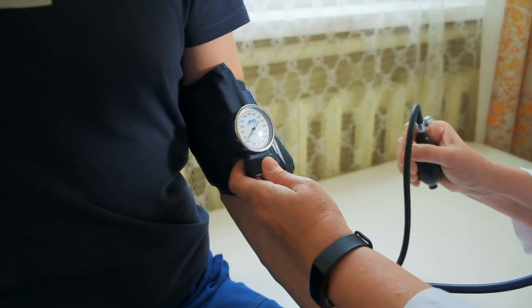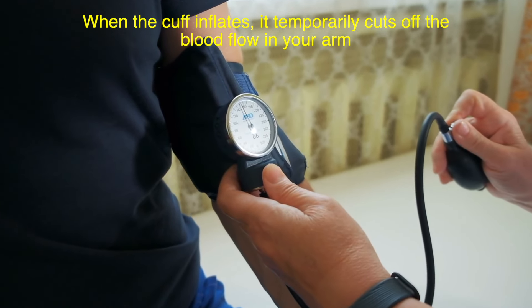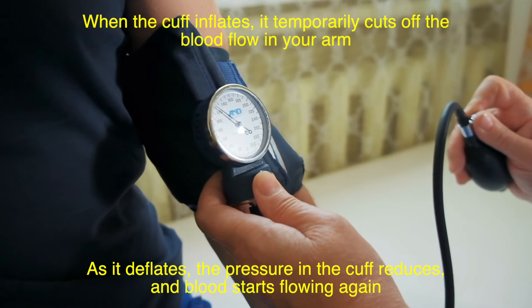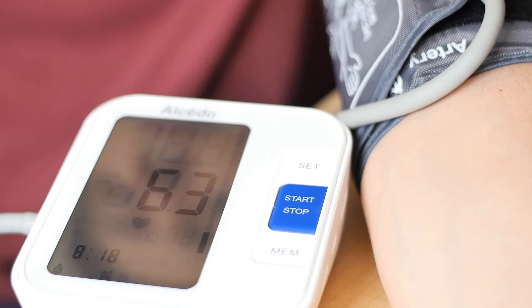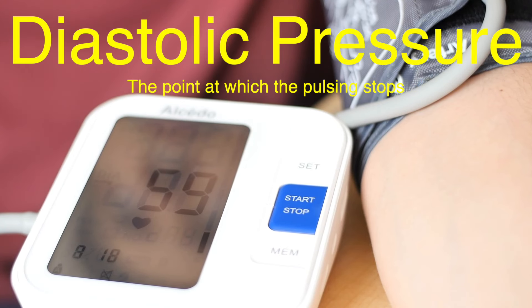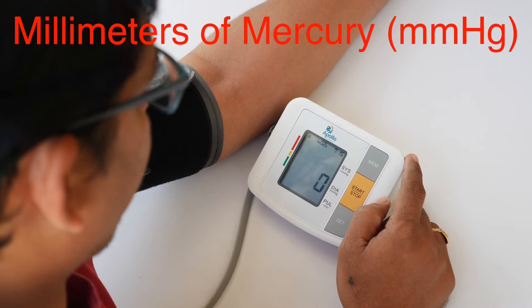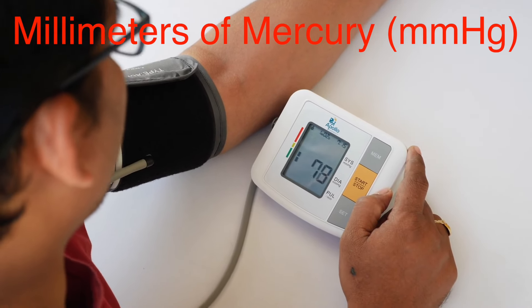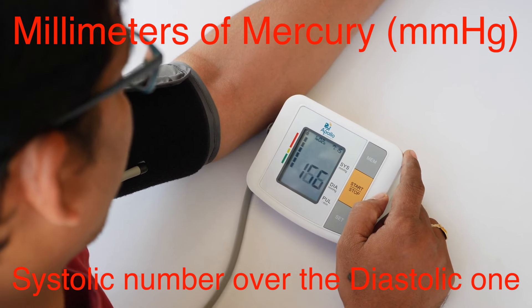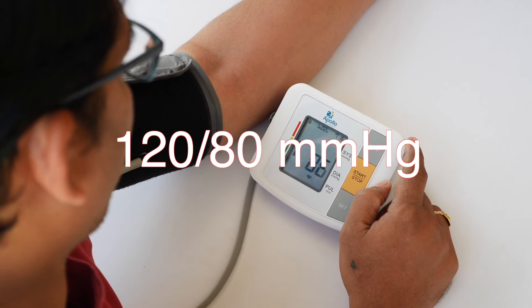The principle behind it is simple yet ingenious. When the cuff inflates, it temporarily cuts off the blood flow in your arm. As it deflates, the pressure in the cuff reduces and blood starts flowing again. The point at which the blood begins to pulse through the artery is called the systolic pressure — that's the first number in a blood pressure reading. The point at which the pulsing stops is called the diastolic pressure, the second number. Your blood pressure reading is given in millimeters of mercury, mmHg, with the systolic number over the diastolic one, like 120 over 80 — that's your typical healthy range, though it varies depending on the person.